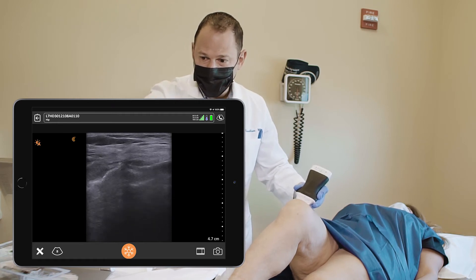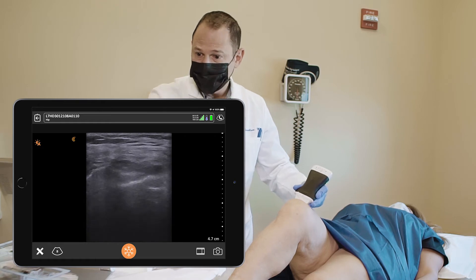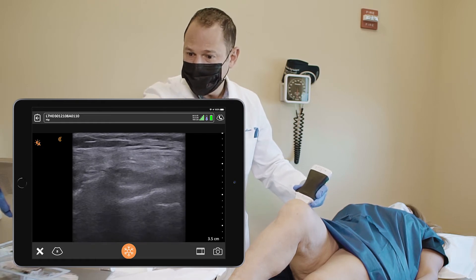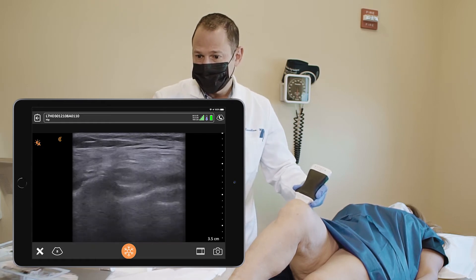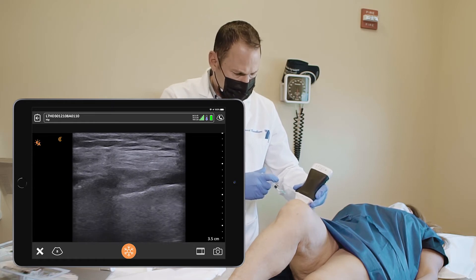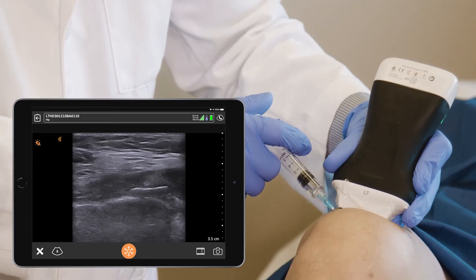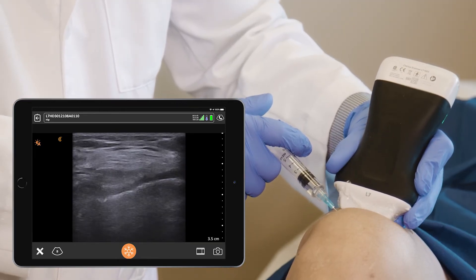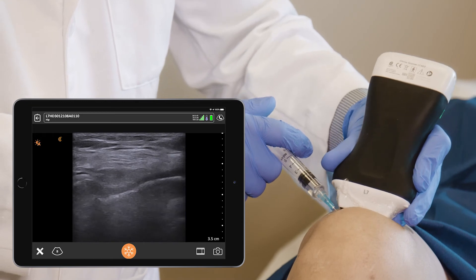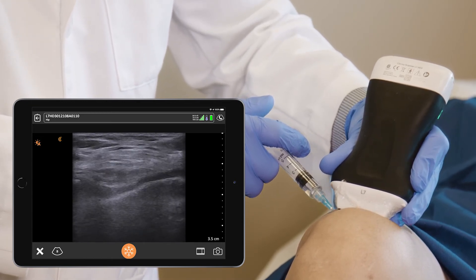I'm going to give you a lidocaine injection first, okay Rosie? I'm going to decrease my depth. A little pinch. We're slightly out of plane, and sometimes the patella may interfere with your ability to see your needle tip. But you see the needle here right now.